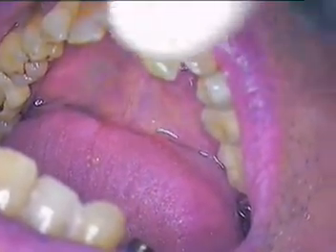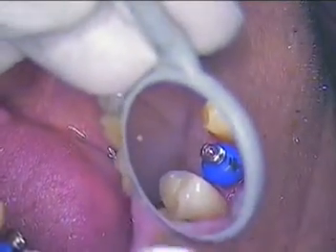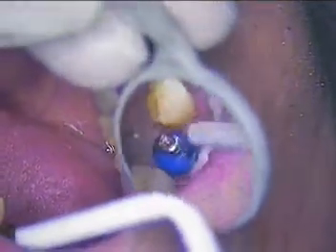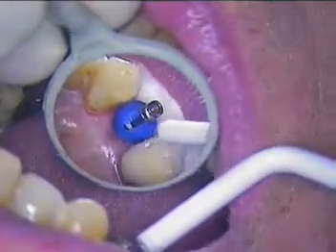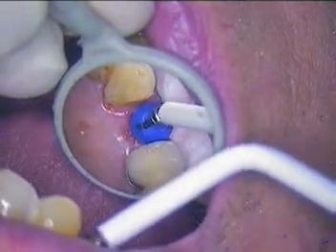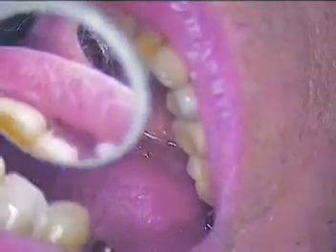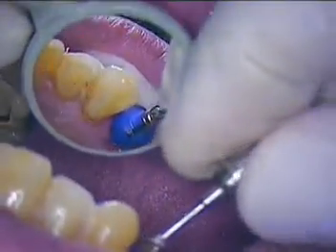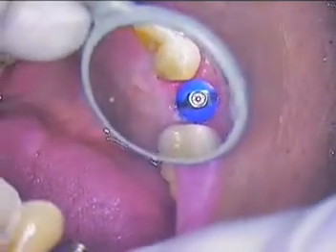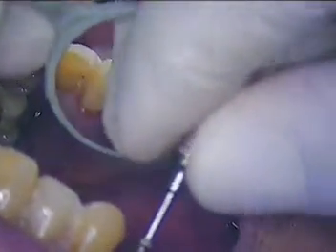Not only that — we don't hardly see any tissue blanching here. Now, there's a little irritation, but Luigi's been wearing this particular temporary for a while. The next thing we're going to do is add a little bit of wax to the top of this, because we want to cover that screw during the impression. That's a very important step, so that when we go to reseat this impression transfer coping, it seats without any interference. You don't want the image of your screw head in your impression, so we have to cover that.